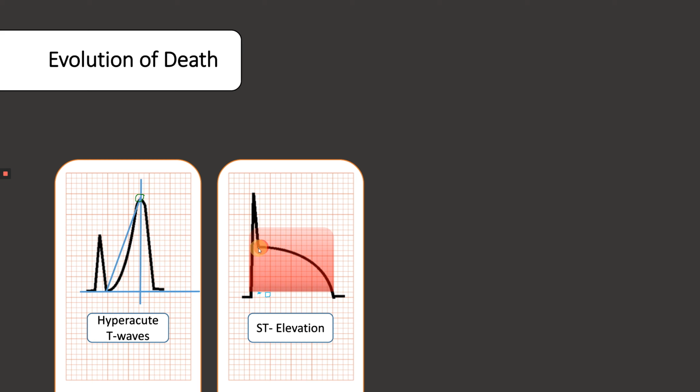As you can see here, this is many tiny blocks tall, because here's my isoelectric line. That's my line of reference right there. So this counts as ST elevation. So this is active cardiac damage being done right here. We know that we need to see this in 2 or more contiguous leads in order for it to be clinically significant as an MI. And we'll take a look at what that means here in the next little bit.